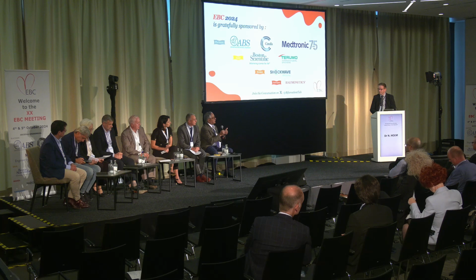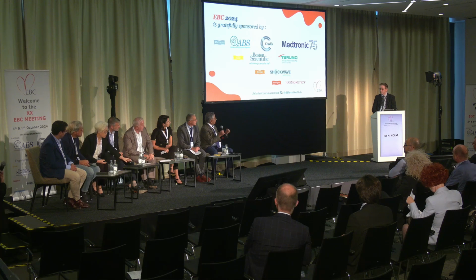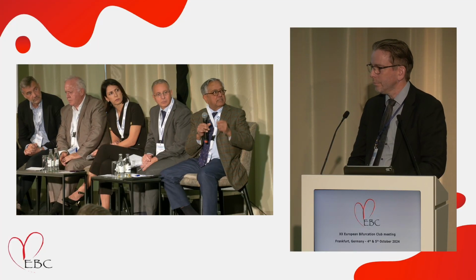So Niels, obviously people should be trained to pull back the guide before they move things around in the left main. So first of all, do you see deaths associated with this deformation in your MACE category? Secondly, in the OCT pullback, did you notice the guide just moving forward with the mechanized motion of the device?